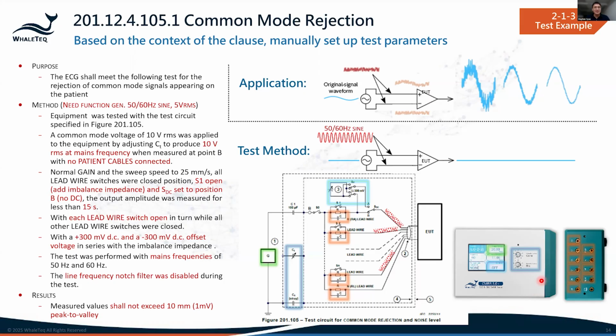The test method is to give both inputs of the ECG amplifier, so every lead is given the same signal, and the signal is actually simulating the mains power noise. When every lead is given the same signal, that is the balanced condition, and we're asking the CMR ratio to be minus 89 dB according to the 60601-2-25 standard.